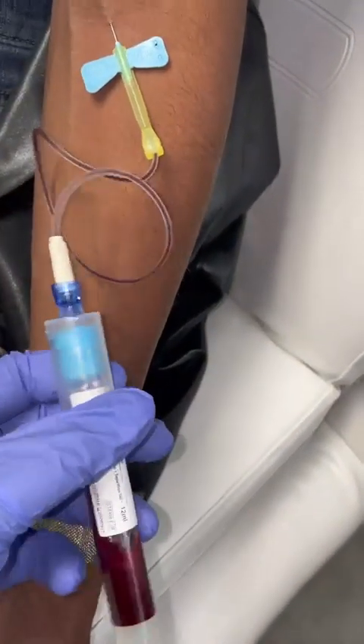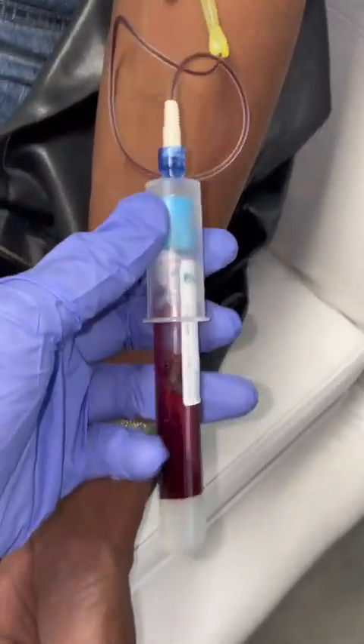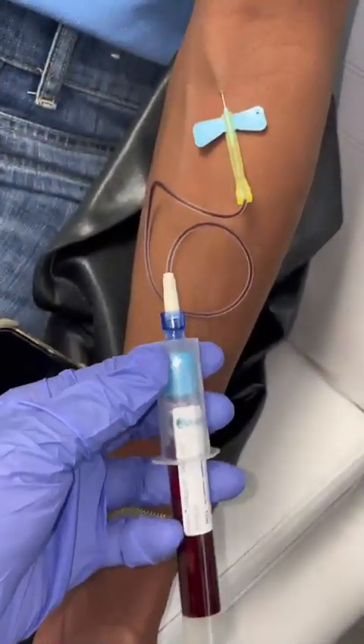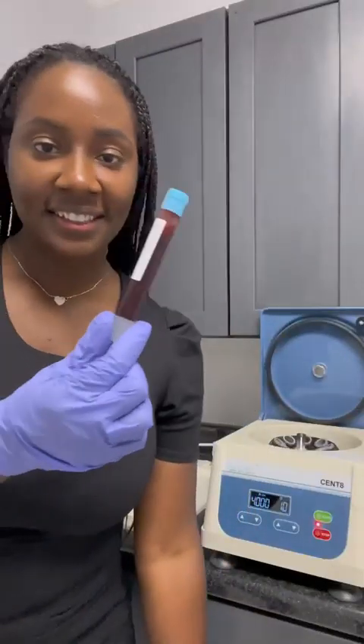I am Aesthetic Nurse Crystal and have been using Juventix products and supplies since 2019. This is me using their Phlebotomy Toolkit to prepare a microneedling PRP procedure.